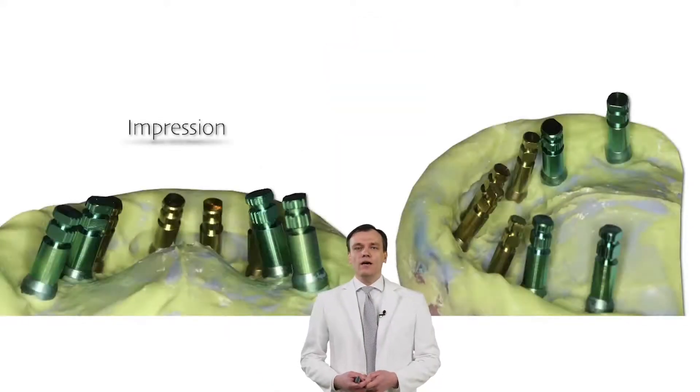Hello and welcome to this prosthetic hands-on session, during which I'm going to show you my developed method of impression taking.